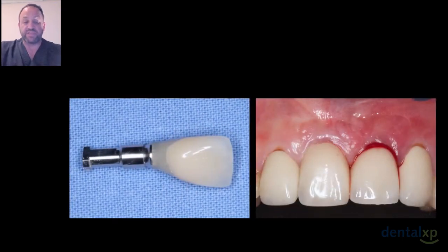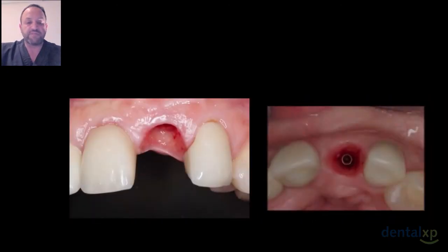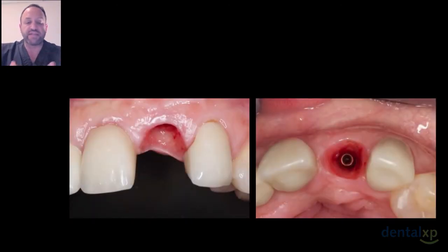And in this case, we did what we call the walkout. As a lot of you who know my work will know, this is the way I prefer to do it: put the patient's own crown back in their mouth so that they have very little idea of what's actually happened, because it looks absolutely the same as it was before, even if the crown didn't look as great as it could. And with everything set in place, you can see the phenomenal soft tissue that we've created and maintained.